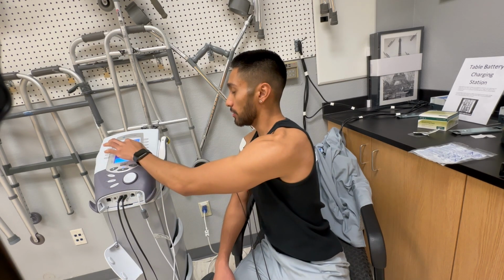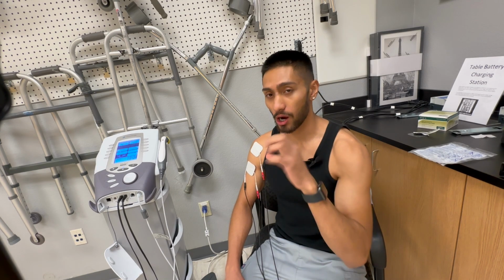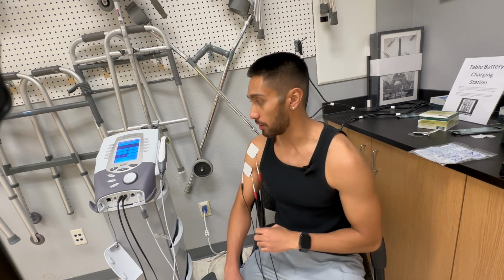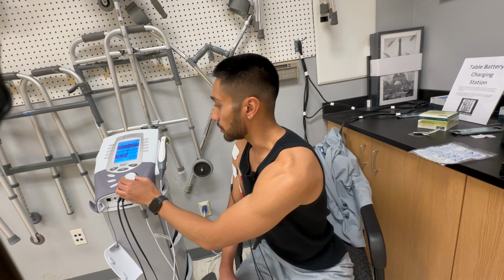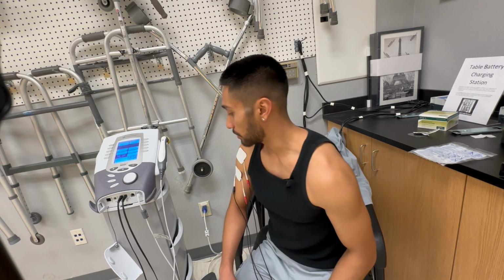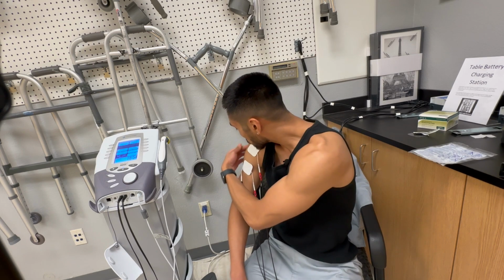So right now, the frequencies are going between 2 hertz and 10 hertz. That's just varying how much delivery and output is going to go on in the treatment area. Still having some twitching going on, so let's adjust that down until I only feel tingling sensations.